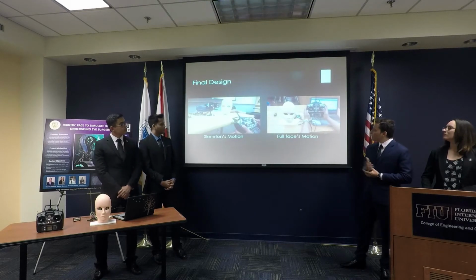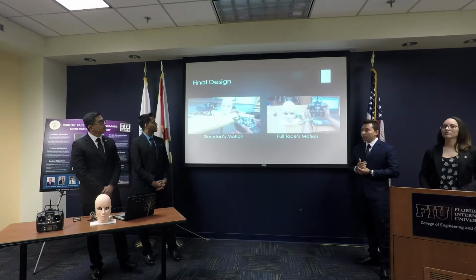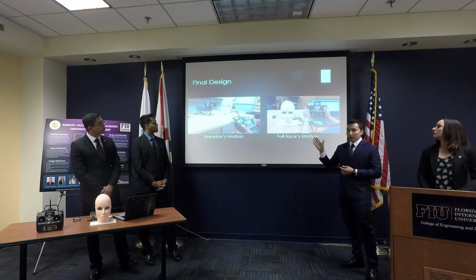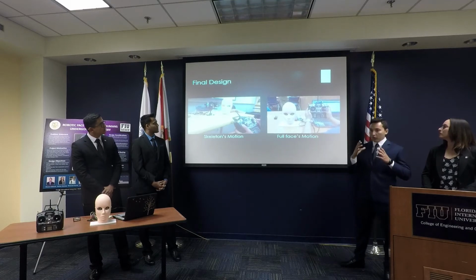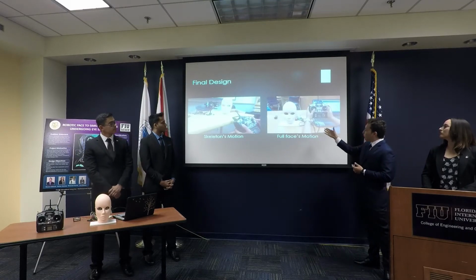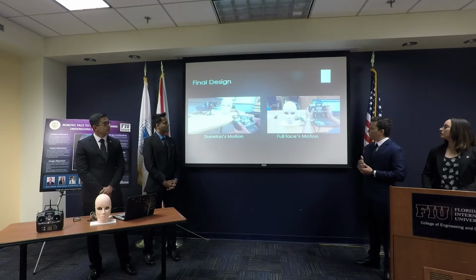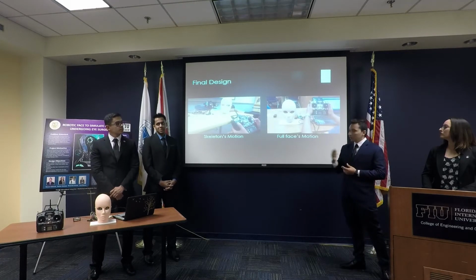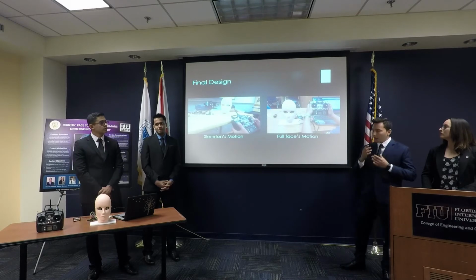So these are two videos of testing the prototype. Over here, as you can see, we're trying to achieve accurate movement as a human would do. Same here, this is the full configuration, the eyelids closing and the eyes movement. So we were testing the accuracy of the eyes.